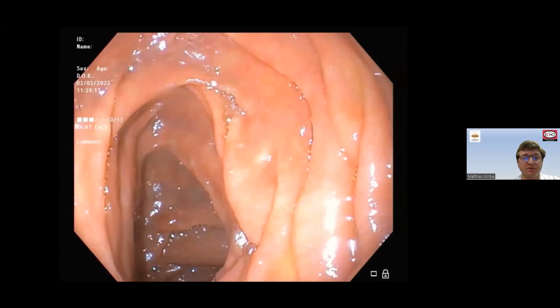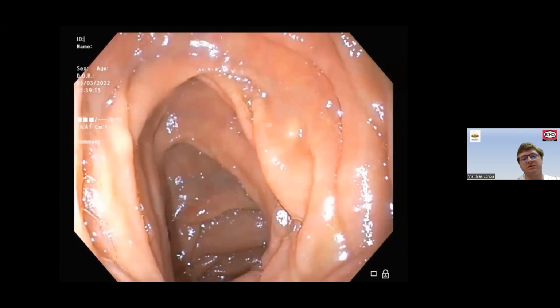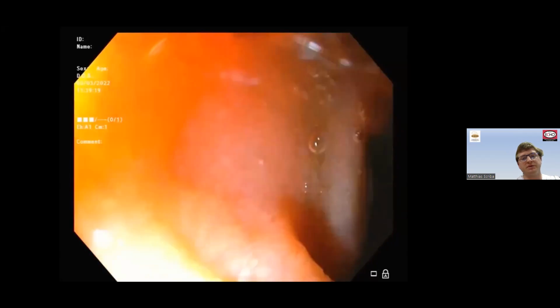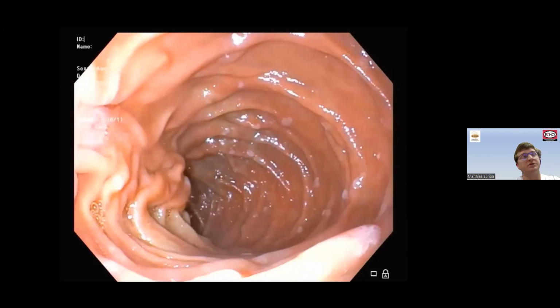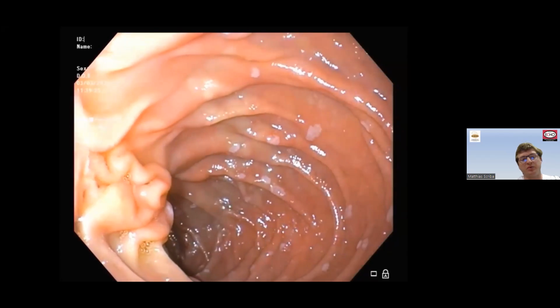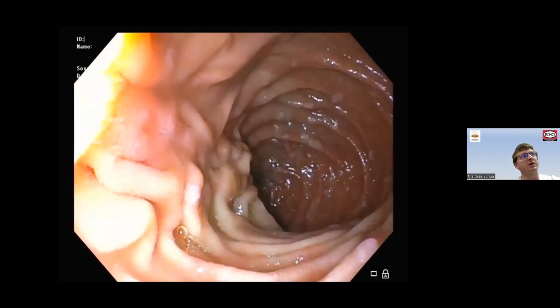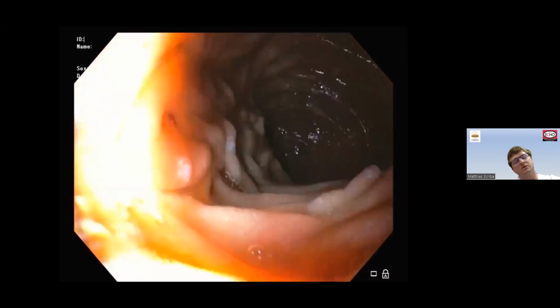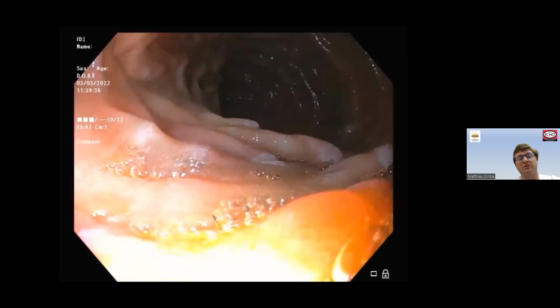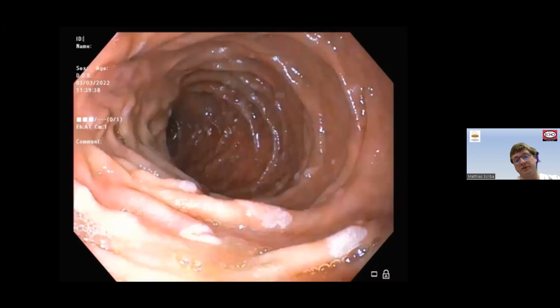And although they look a bit similar to what Galia just showed you in Peutz-Jeghers, or one of the hamartomatous polyps, these actually are adenomas. And so this patient is actually one, although she wasn't fully aware of it, who has actually had FAP and already had her prophylactic colectomy done at a young age. So here we're dealing with a patient with FAP, some 12, 13 years later, which is the typical time period that they present with duodenal polyps. And the question is, well, what do you do about them in patients with FAP?